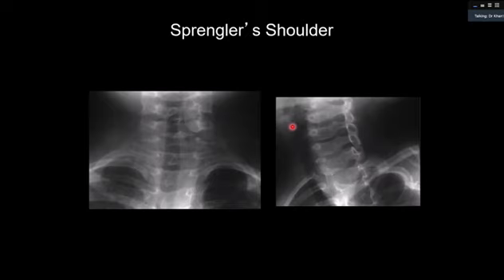This is another example where you can see similar to the last case.